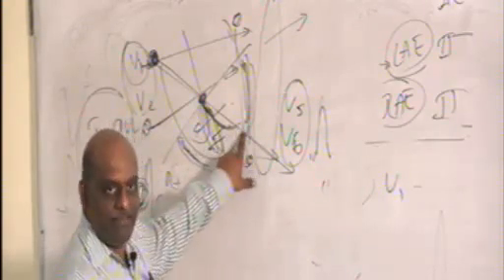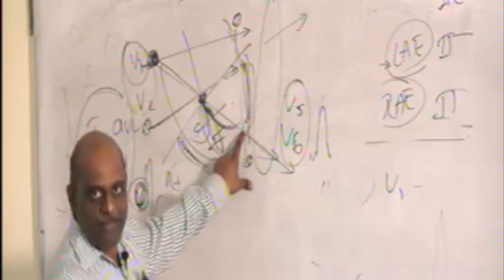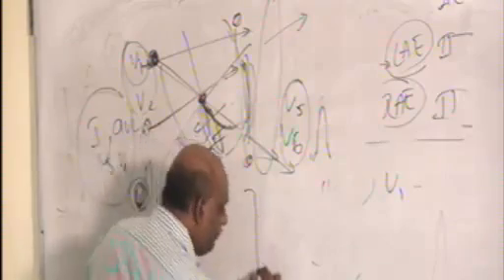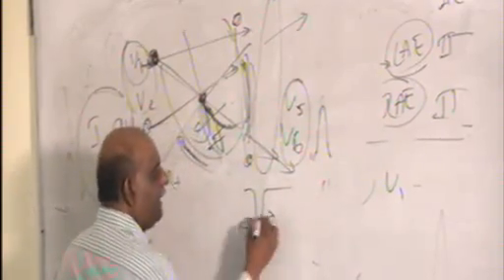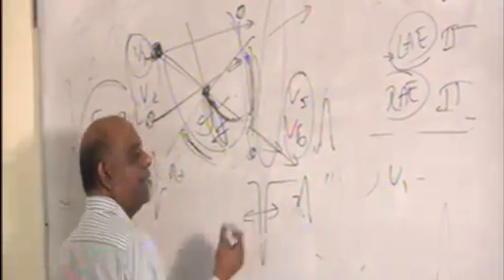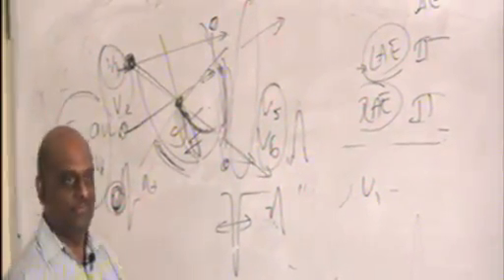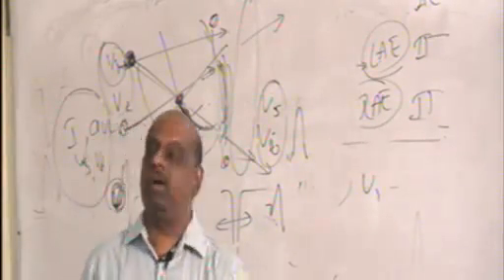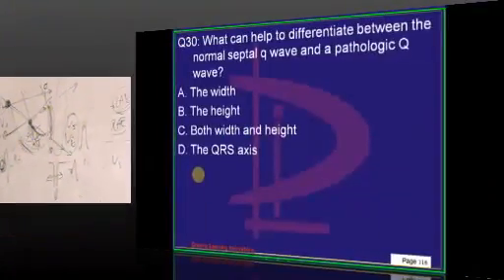If the left ventricle suffers infarction, then you get pathological Q wave in the left sided leads. That Q wave will be deeper, wider than the normal Q wave that comes before R wave. In V5, V6 and lead 1 and AVL is what you have to basically remember.